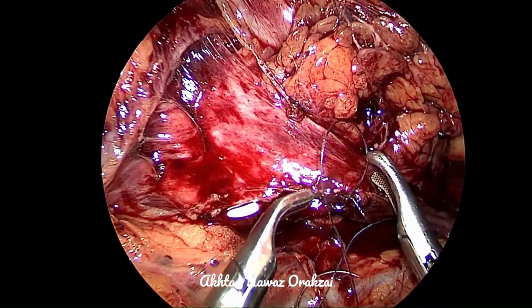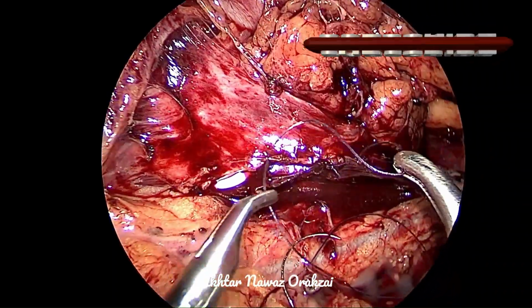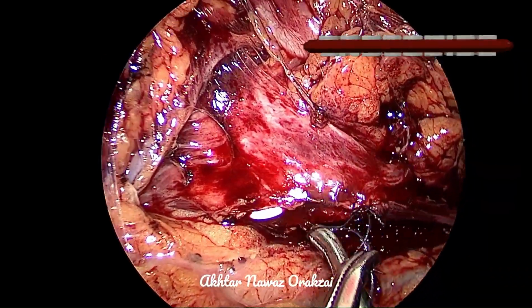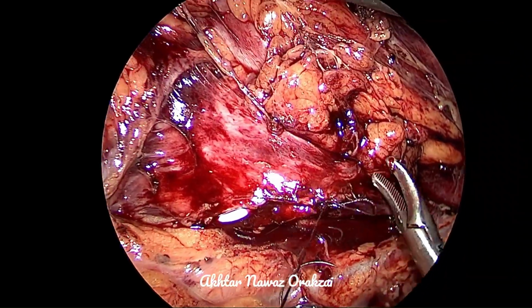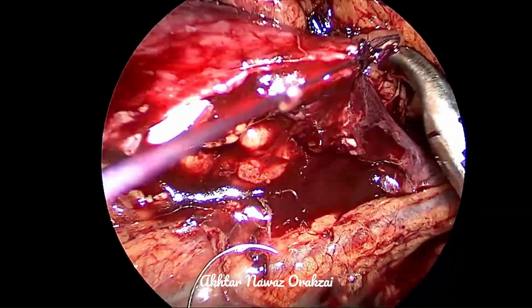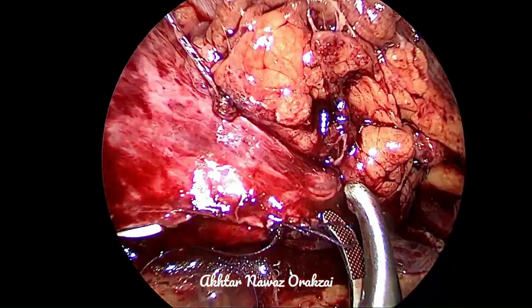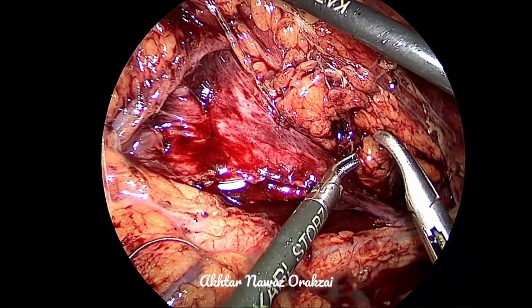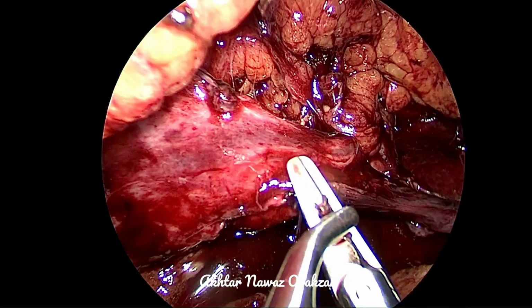So one of the methods of doing a knotting is making C and reverse C, and here we are using another method which is a little more easy as compared to the making of the C. So once we are done with it, we will cut the loop, and we will continue with the suture towards the apex of the pelvis.